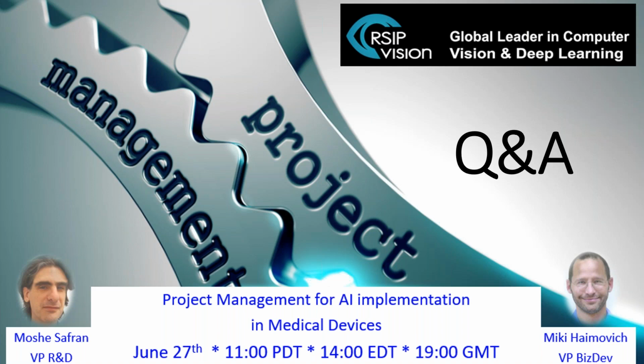And these are not necessarily things that you can solve by taking the experienced radiologist or pathologist. Two experienced radiologists would still disagree in many cases. So that's just how it is. Our role to some extent is to try and copy what you, the customer, define as the truth. We call it the source of truth or the ground truth.